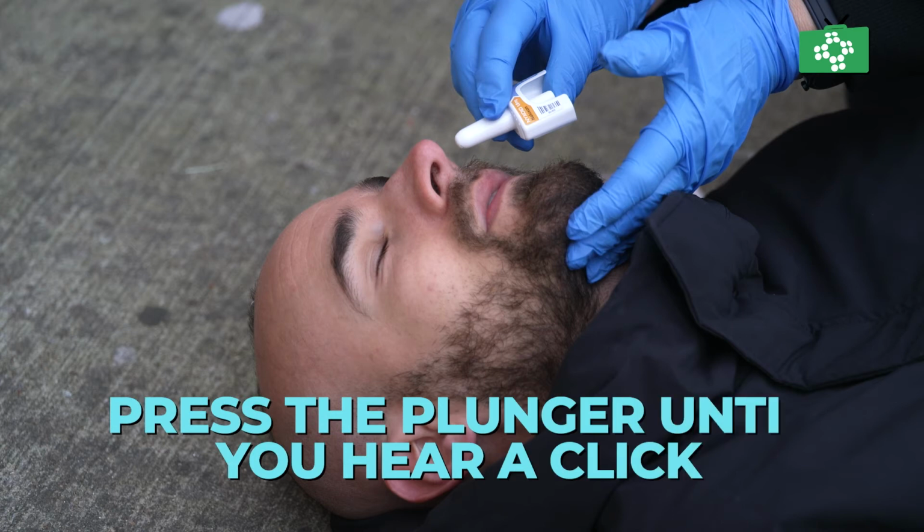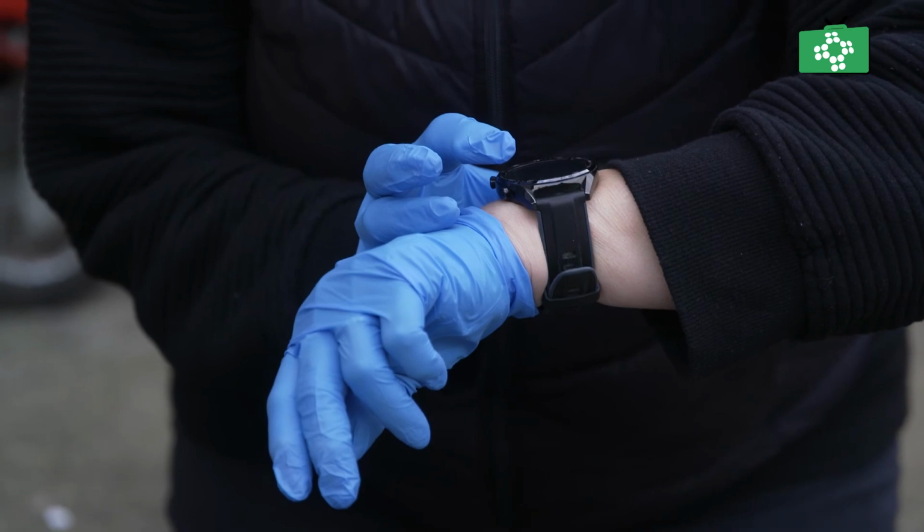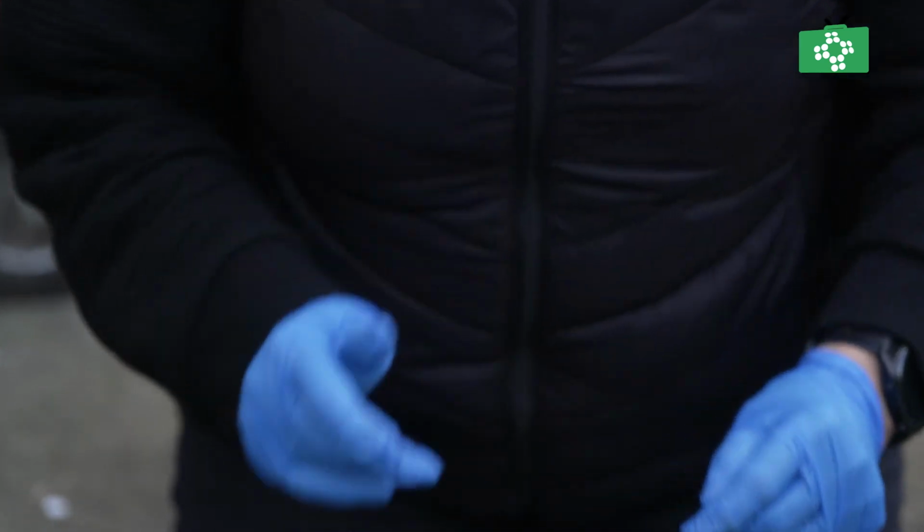Now that you're ready to administer the dose, press down on the plunger until you hear and feel a click. This is how you know that the dose has been administered correctly. Like with the pre-dosed injection, note the exact time that it's been administered, and in the case of nasal spray, also note down which nostril you used.